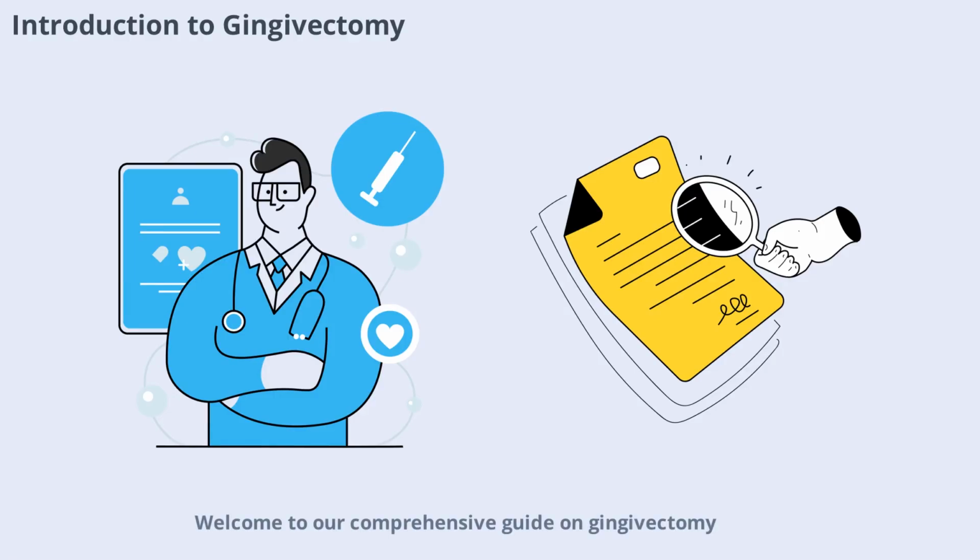Welcome to our comprehensive guide on gingivectomy, a surgical procedure that involves the excision of the soft tissue wall of the periodontal pocket. Gingivectomy is a vital technique in periodontal therapy, helping to restore oral health and improve aesthetics. In this video, we will explore what gingivectomy is, its prerequisites, indications, contraindications, and the various techniques used in its practice. We'll also discuss related procedures like gingivoplasty and examine the healing process after surgery.